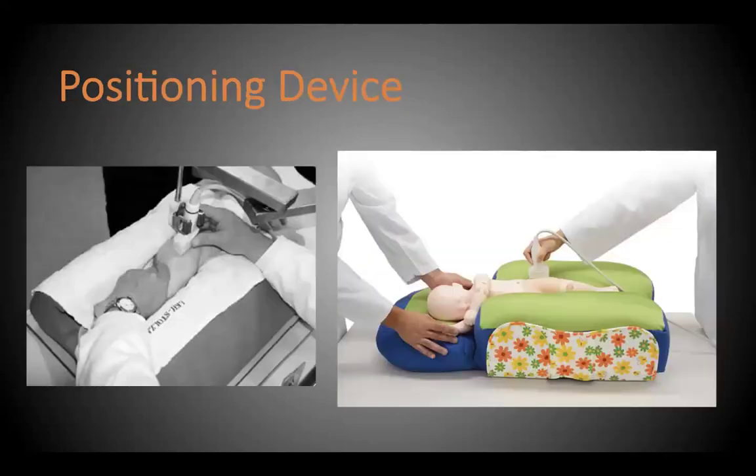So, Professor Graf has described the use of this cradle and probe guide that he uses for each and every patient who undergoes an ultrasound scan by the Graf method. We unfortunately don't have access to this, but being on the Graf course recently, I've realized that using this cradle and probe guide actually makes your work quite easy, and you're able to scan the hip within a few seconds.